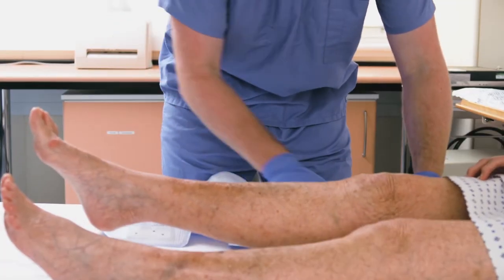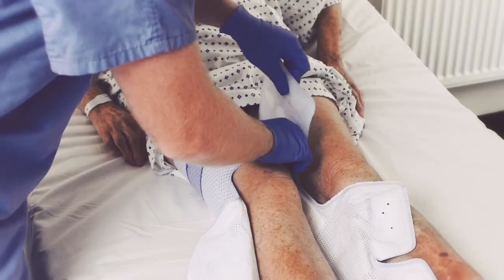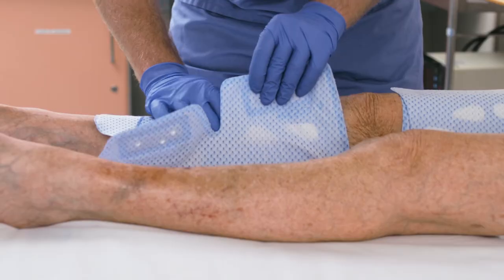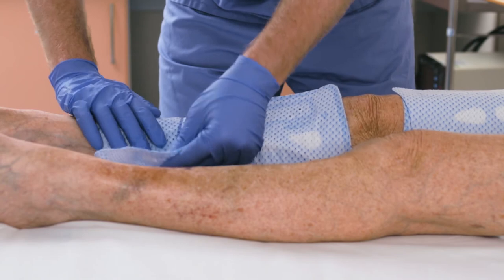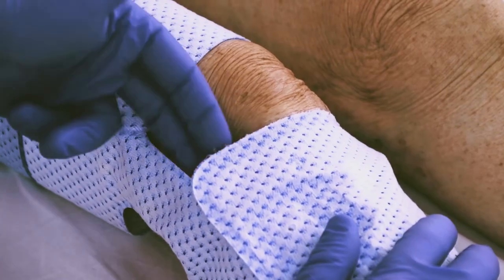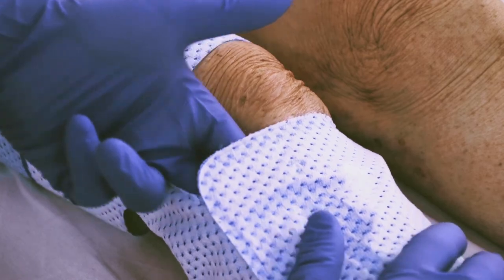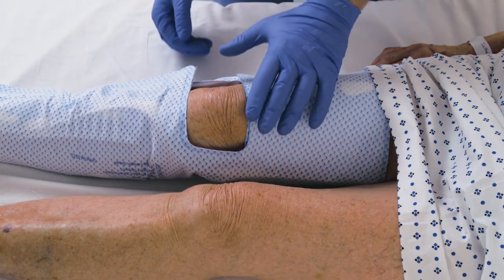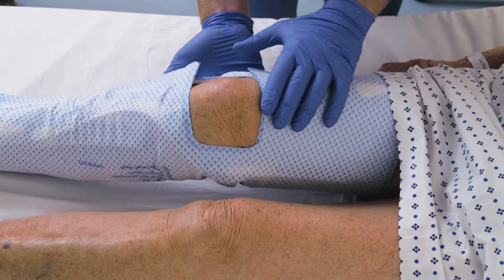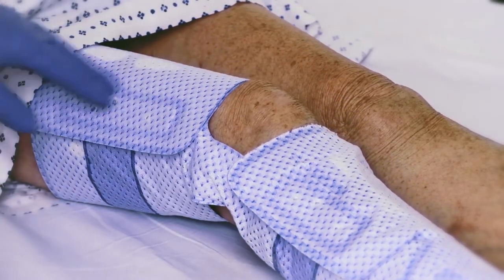To place the thigh length sleeve, first orientate it with the back of the patient's leg, then wrap the sleeve around the leg, fastening the Velcro closure tabs. Make sure to leave approximately two fingers of space between the deflated sleeve and the patient's leg. Ensure the gap in the thigh length sleeve is positioned at the patient's knee to avoid compression at the popliteal area.